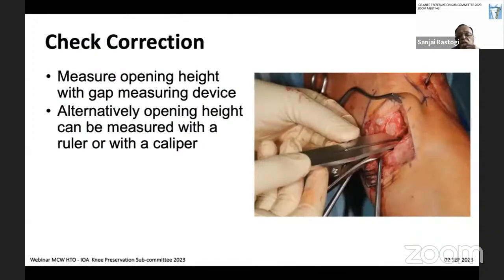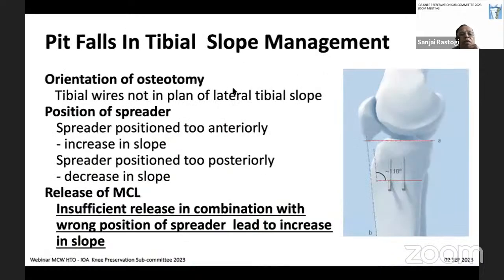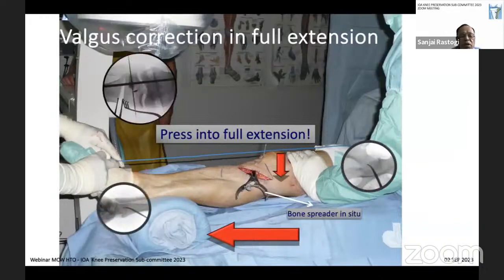Then we measure the opening, and then we can fine tune with the spreading chisel by seeing the alignment rod, or a cautery from the head of the femur to the ankle joint, and it should pass through the Fujisawa point for the correction. If the osteotomy orientation is not parallel to the lateral tibial slope, this will lead to a change in slope. If the spread is put anteriorly, there is increased slope. If the spread is put posteriorly, there is a decrease in slope. And if the MCL is not released, there will again be more opening anteriorly. So these are the precautions which must be taken. The final correction is seen with full extension on table.